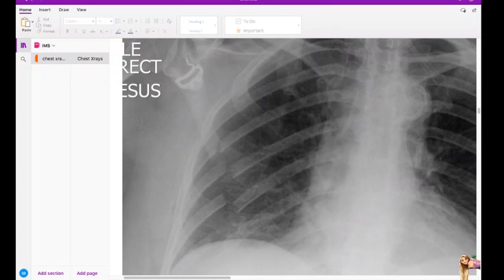Yeah, it is also a clinical diagnosis, I think. But then, I'm not sure.